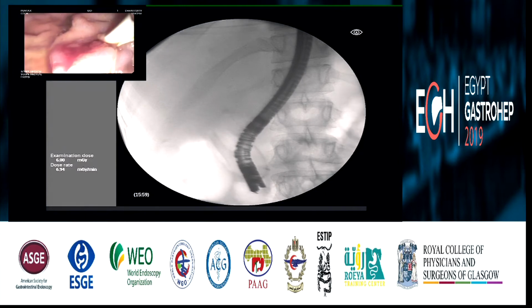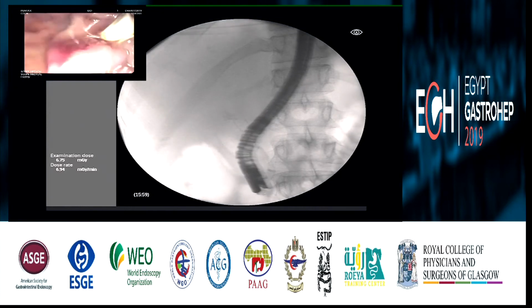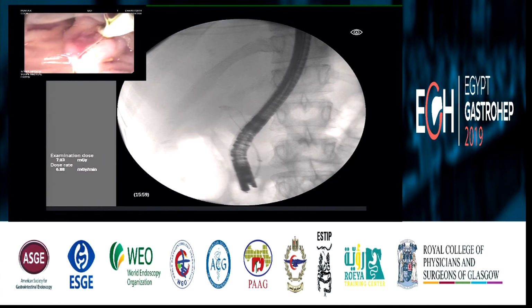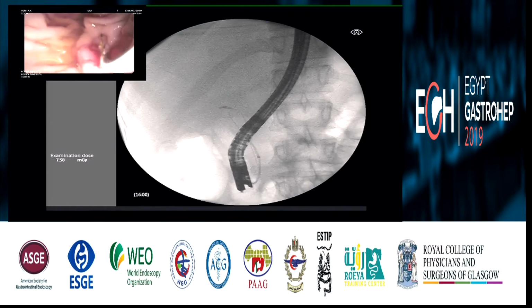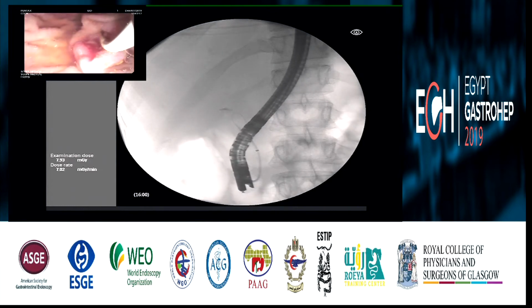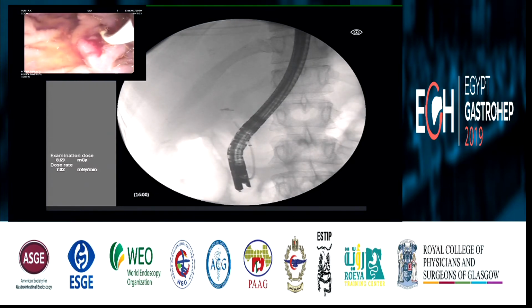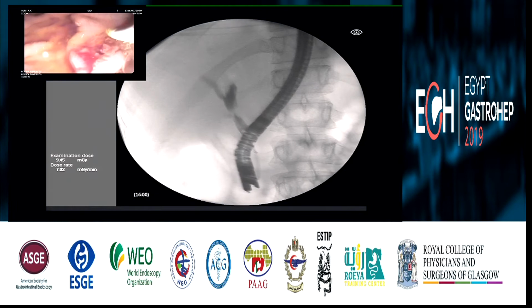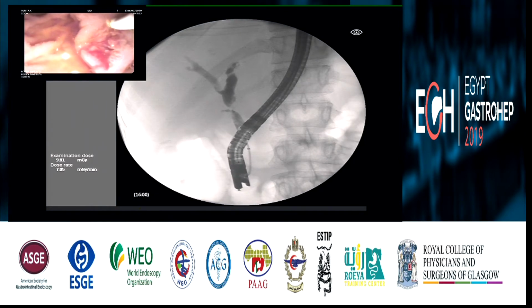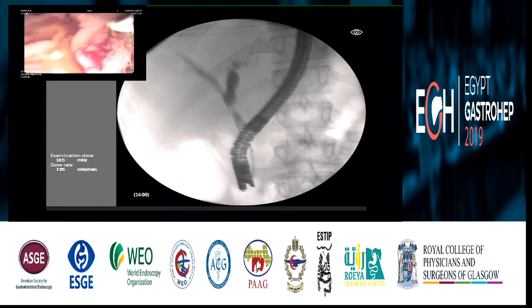It doesn't go. Now we inject some contrast just to see the way. So it appears we either are on the cystic duct stump, we'll see now, or below a very tight stricture in the main duct. Inject contrast. We will inflate after. We're going to put some contrast. Inject, outline the bile duct. Since the guide wire is not going, we see some air cholangiography. Okay. And the stricture looks really tight. Can you inflate a little bit, please? Okay, it's inflated already.